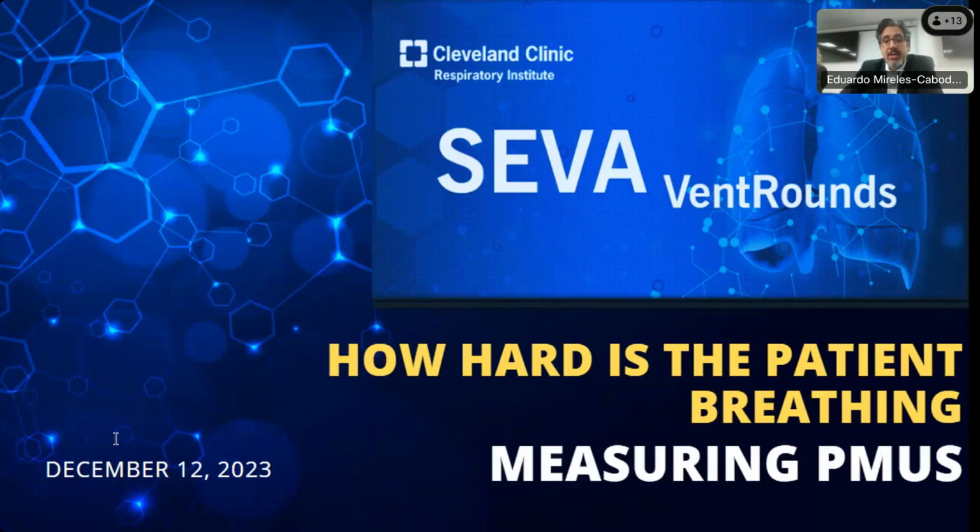And the final one is an ascending relationship, in which, as the patient starts doing more effort, the ventilator will deliver more pressure. And so this proportionality is in the modes that have a proportional or servo targeting scheme. And the two classic examples are PAV, proportional assist ventilation, and NAVA, neurally adjusted ventilatory assist.